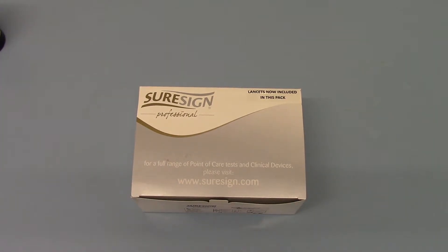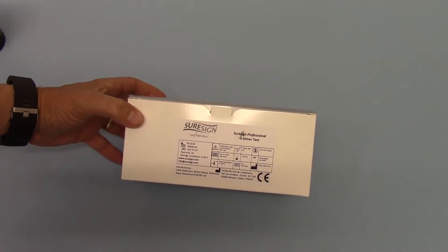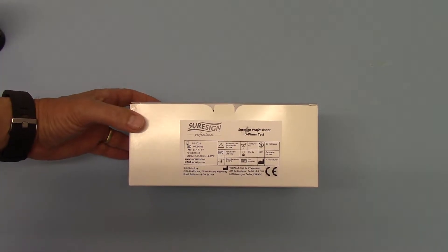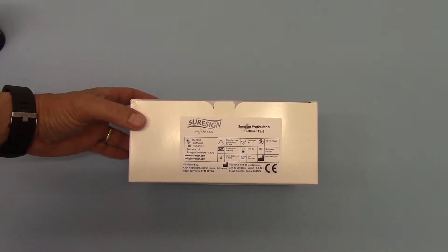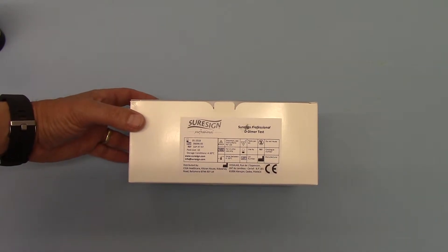Welcome to this product demonstration video where we're showing you the SureSign Professional D-Dimer test kits available from Valumed. SureSign is a professional brand of D-Dimer tests designed for use by physicians in outpatient departments, casualties, and GP surgeries as an assessment of the likelihood or risk of a deep vein thrombosis having formed.